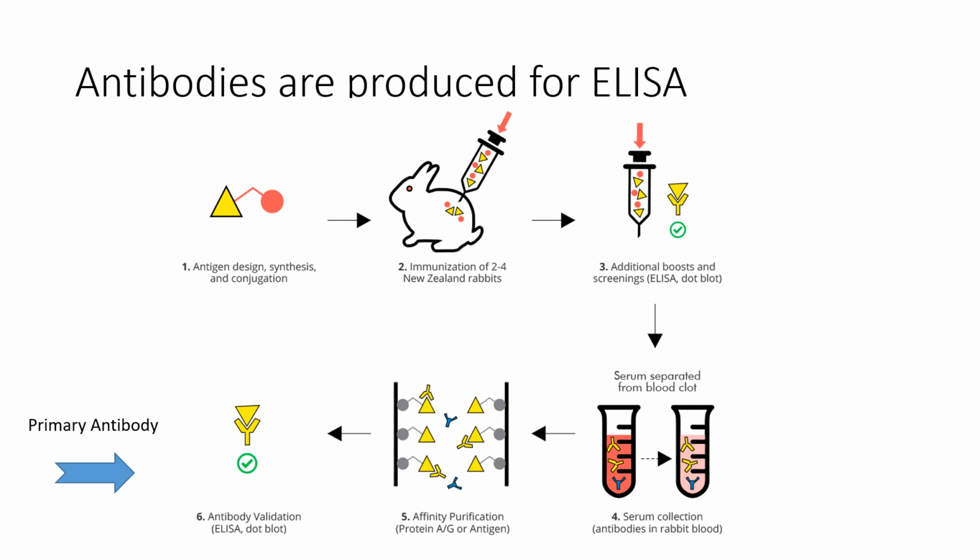And so now they would be able to remove the antibodies, and there'd be all kinds of antibodies in there because the rabbit has also been living maybe with an animal who's sick or whatever other antibodies that it's ever made in its life. You're not interested in all of those. You just want the one that binds to your antigen.